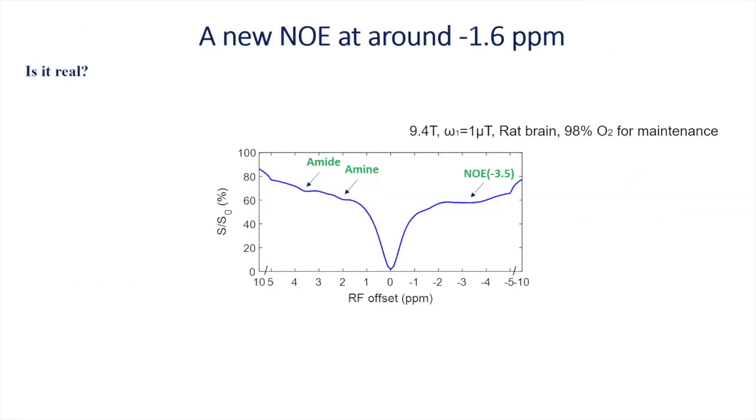Okay, so in the above part, I introduced 3 issues that are related to CEST-specific imaging. In the first issue, how much do we need to correct T1? I suggest that it's necessary at high field, but it may not be necessary at low field or with non-steady state acquisition. So this may address the current debate.